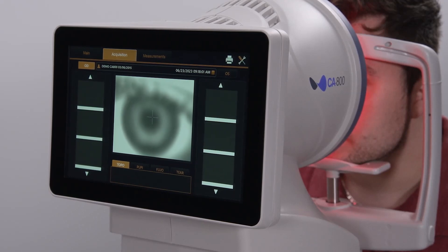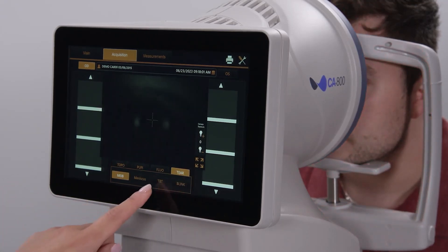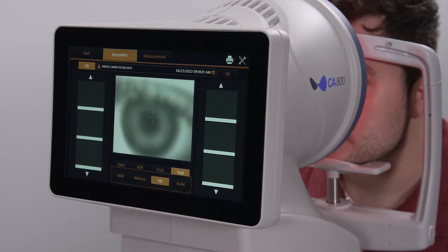The CA800 measures non-invasive tear breakup time as recommended by the DEWS2 report. Simply select the Tear tab at the bottom of the screen, then click the TBT or Tear Breakup Time option.